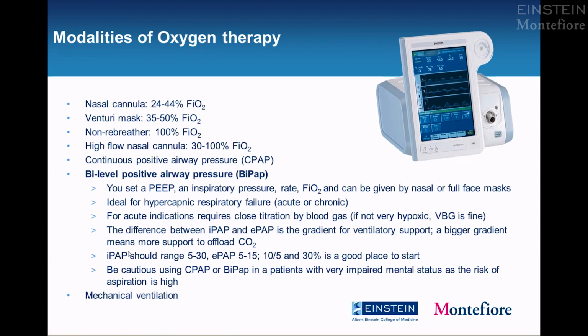So as I say, the differences in IPAP relative to EPAP are what's really the amount of help you're giving the patient. You can look at the tidal volume that's generated, mostly by the patient, just with the support that's given, and that's also really helpful. That plus the minute ventilation give you a sign of whether you're providing effective ventilatory support.